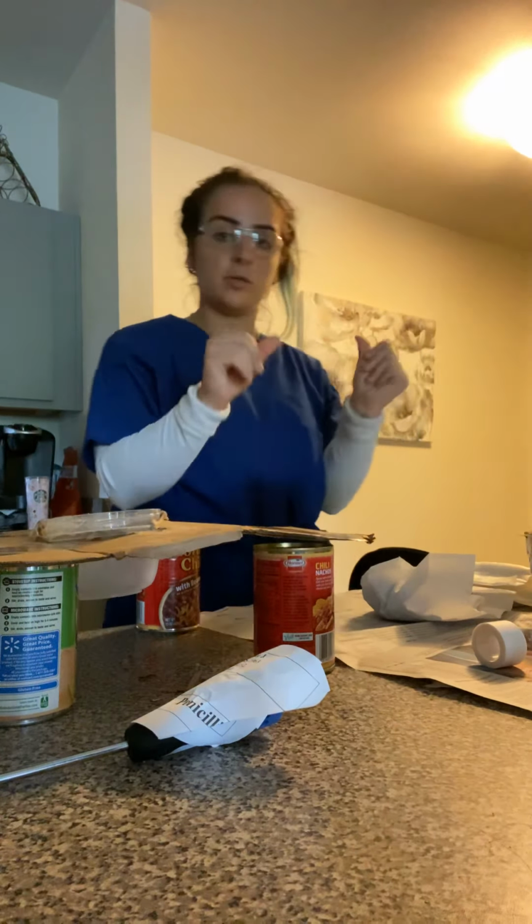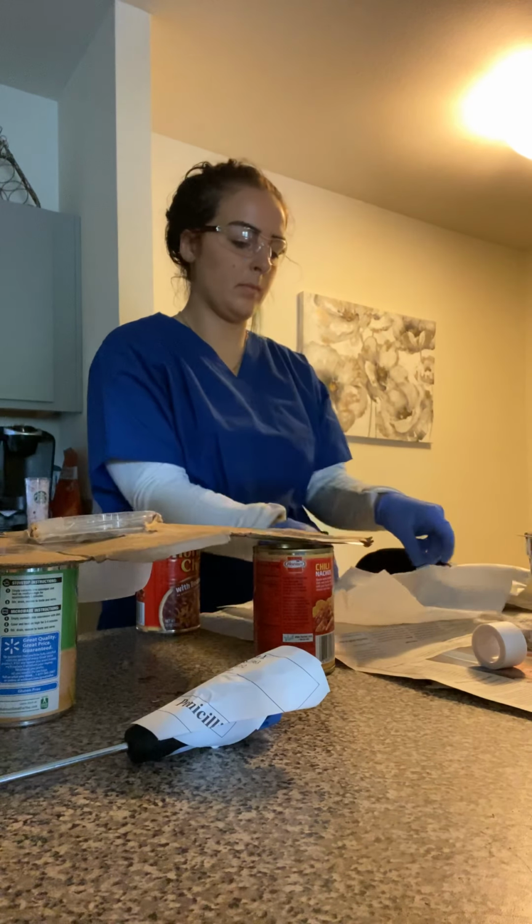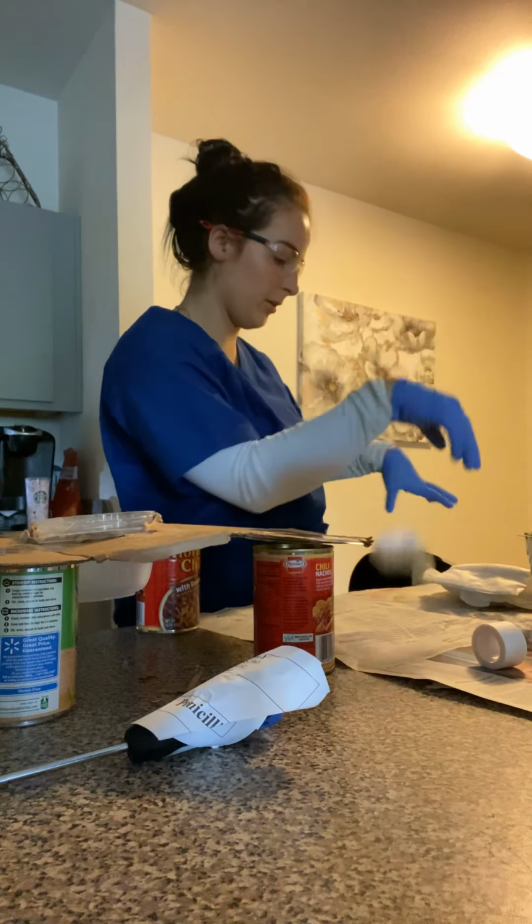At this point too, I'm also going to don my sterile gloves. So here we go. Trying not to contaminate them. Discarding any extra material. So here's my AB packaging for the top of it. At this point, I'm going to start soaking my gauze for the procedure.